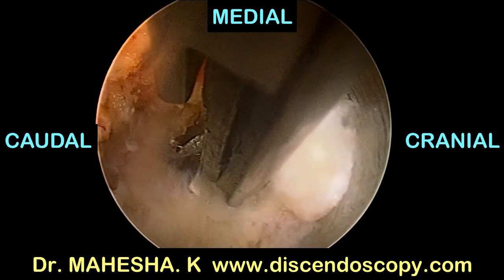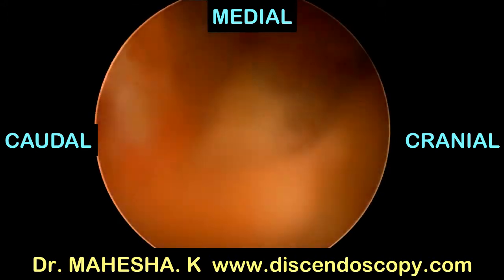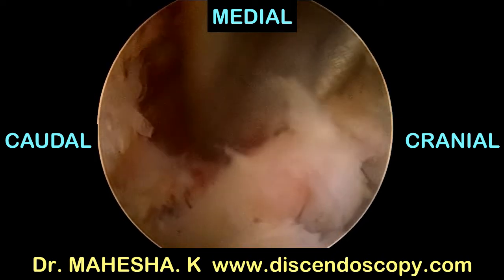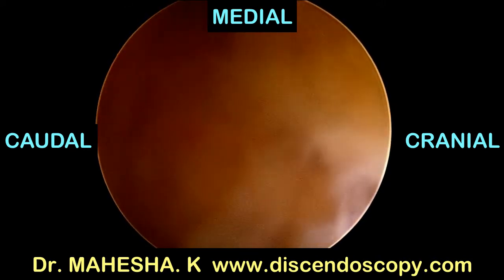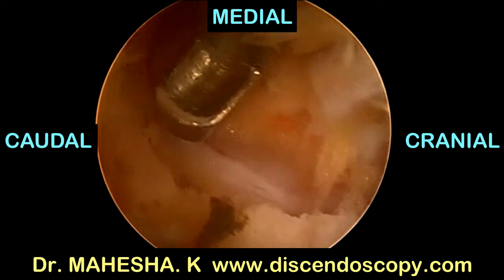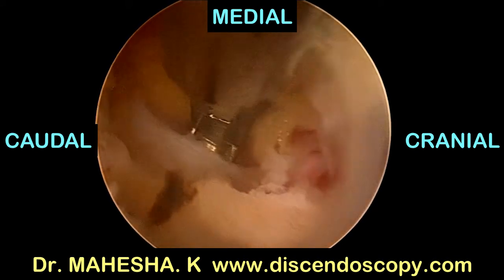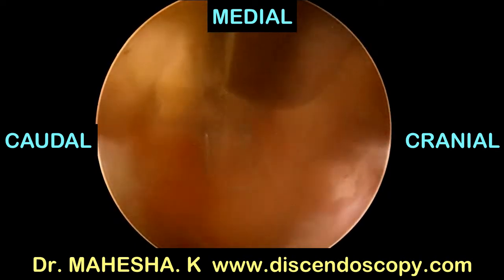Now we go down to the superior edge of the lower lamina, which is resected with the Kerrison rongeurs to free the flavum inferiorly. There will be some epidural bleeding which can be controlled with radiofrequency. Now we go laterally to expose the ascending facet. Using a 2 mm Kerrison, we resect about 2 mm of the ascending facet.